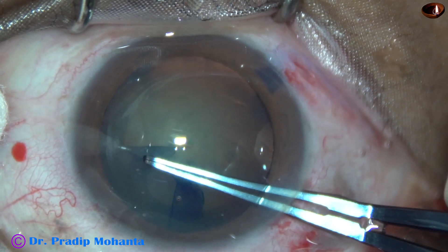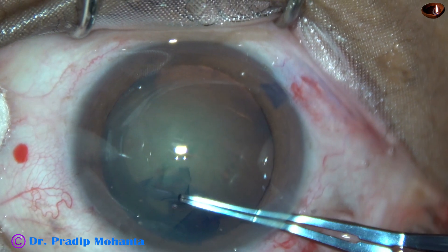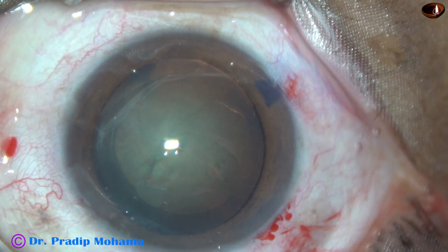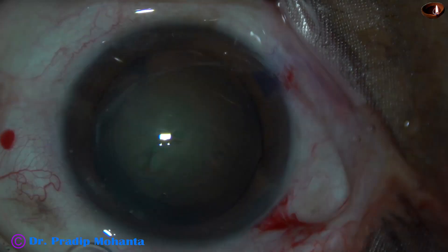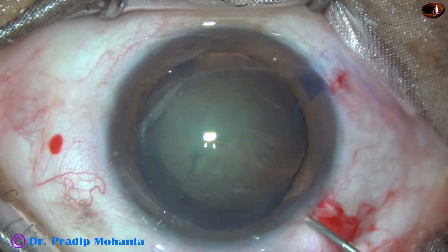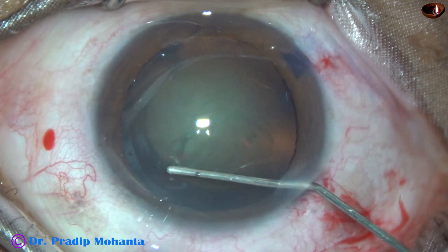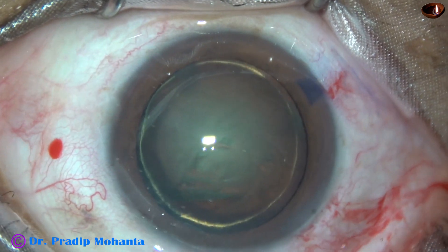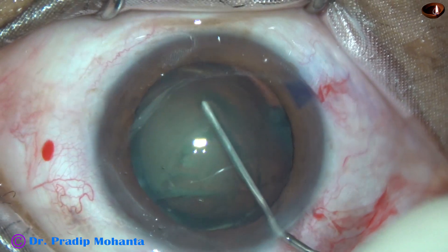The size of this rhexis is about 5.5 mm. Now it is time for hydrodissection. BSS is injected just under the anterior capsular rim with the help of a 27-gauge cannula. The fluid wave goes to the opposite equator. Hydrodelineation is also done.